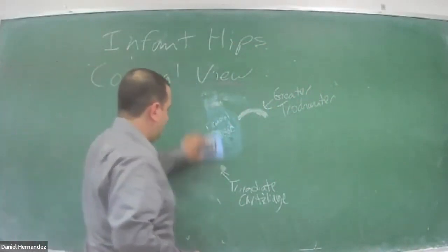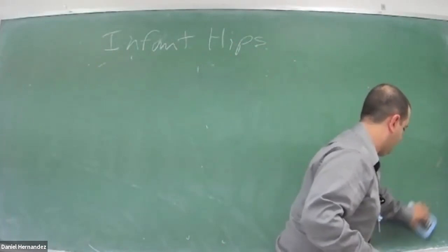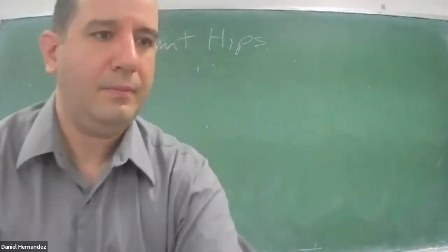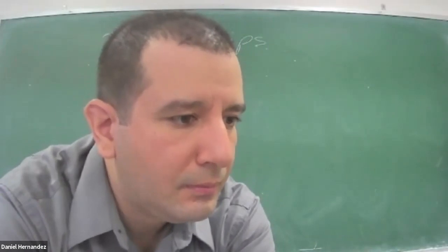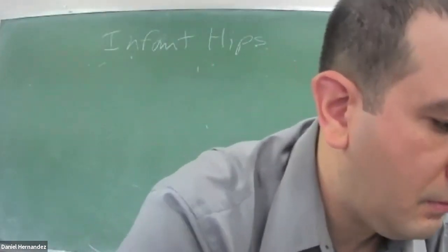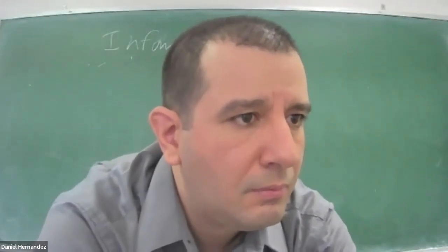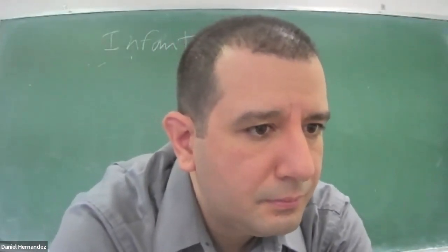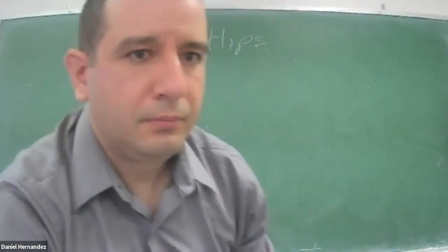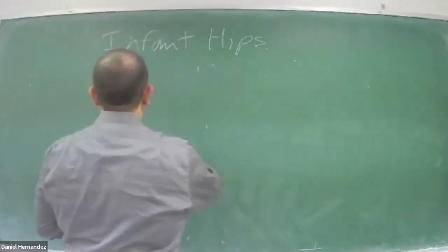Erase this. So then the other view that we do is our transverse view.